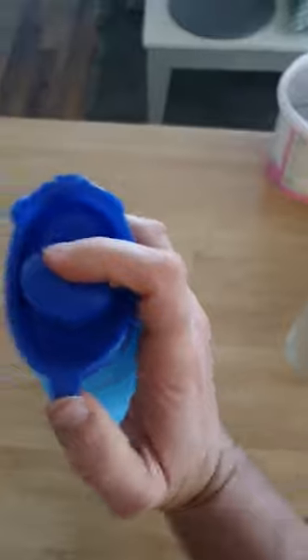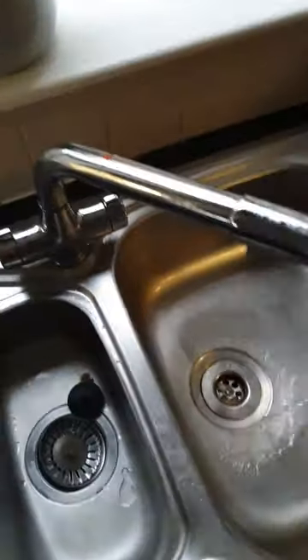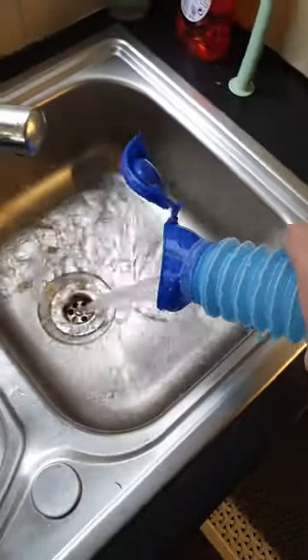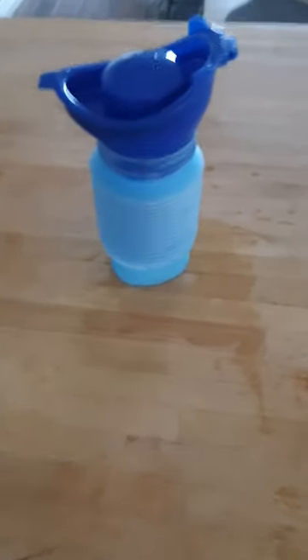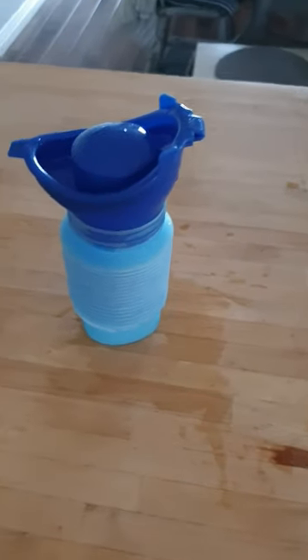Let me just empty this — apologies, I'm doing this all with one hand, or two hands. So I'll just pour that out. As you can see, it is very easily emptied and as easily collapsed. There it is in its collapsible state.